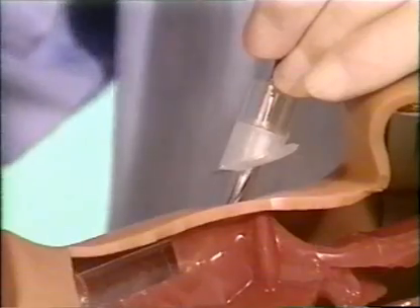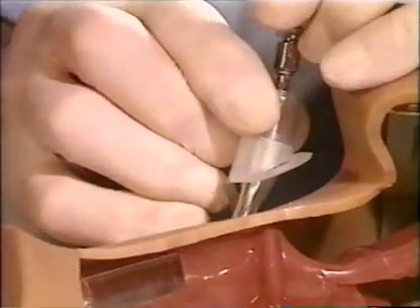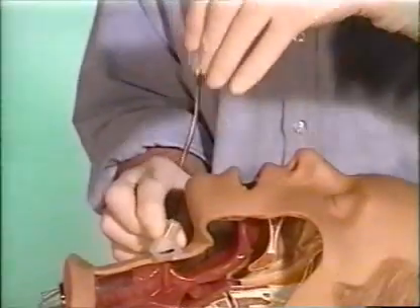Remove the stopper. Hold the steel needle and advance only the plastic cannula. Withdraw the steel needle and advance the plastic cannula until the fixation flange lies on the skin.